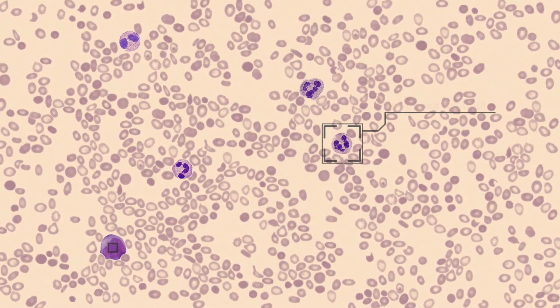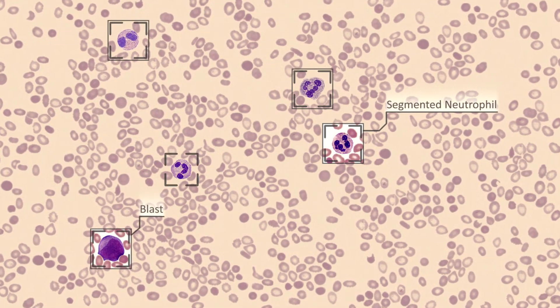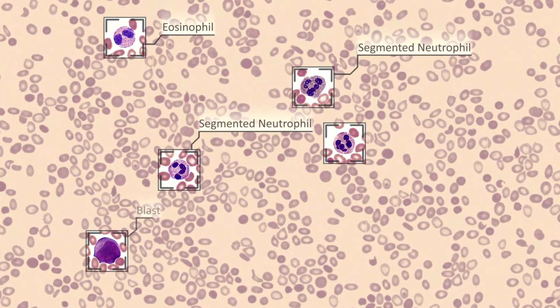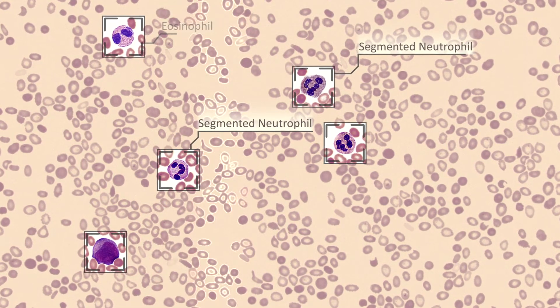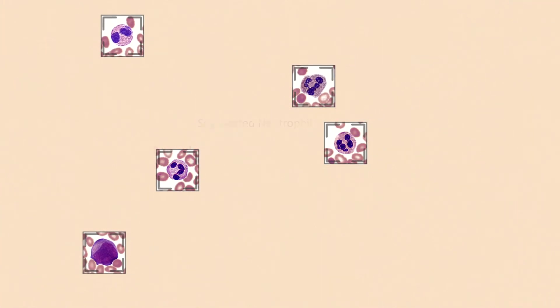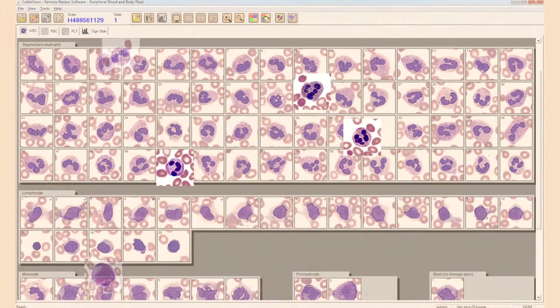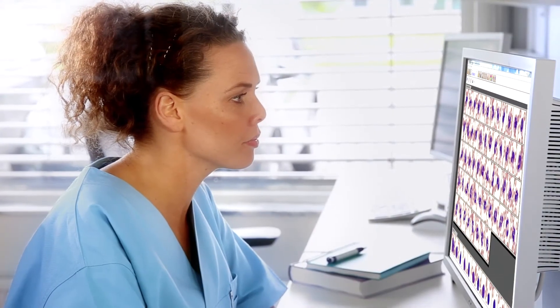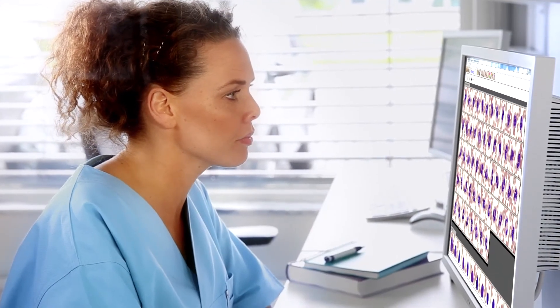Innovative image analysis technology delivers a pre-classification of white blood cells and a pre-characterization of red blood cell morphology for review and verification by a technologist.